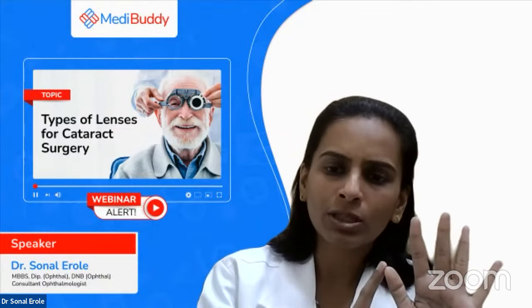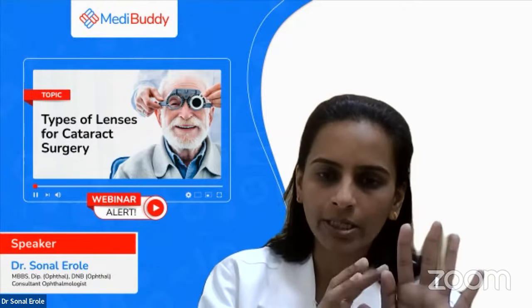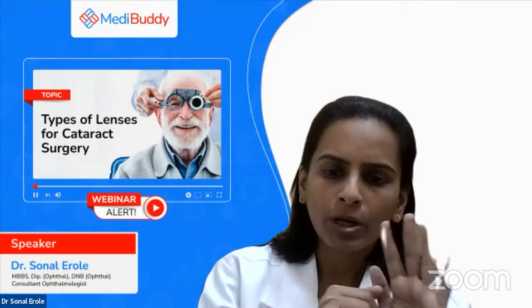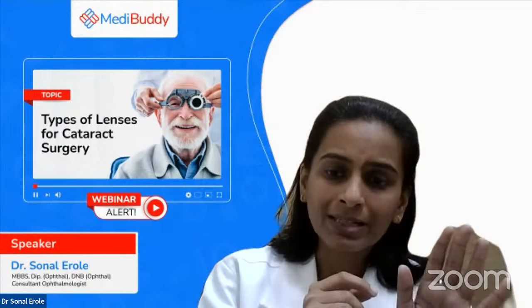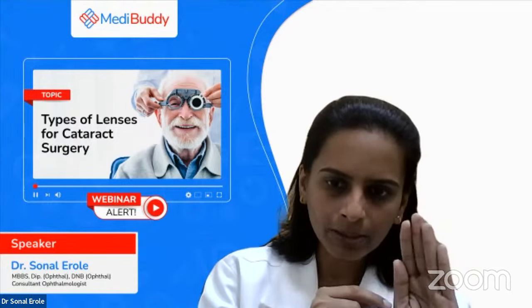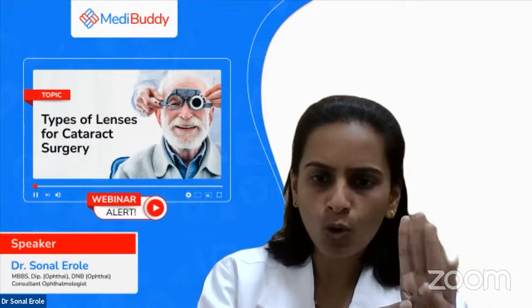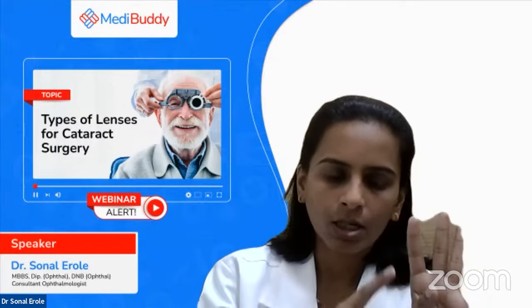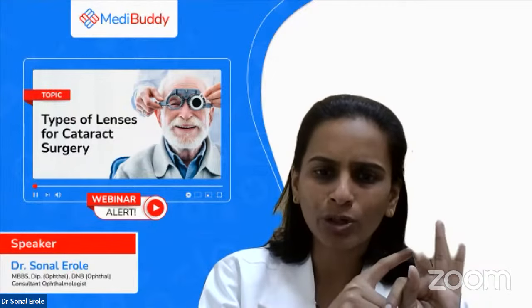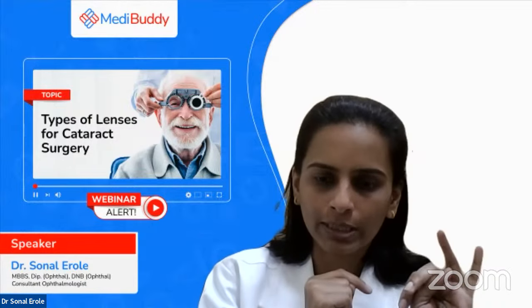To name the IOLs, there are too many companies and so many Indian and imported lenses available, so we can have any type of lens. Basically, to make it a little easier for the patient: those patients who are okay with near vision glasses, those who are already using glasses after 40 and do not have a problem with glasses, can definitely go for monofocal lenses.